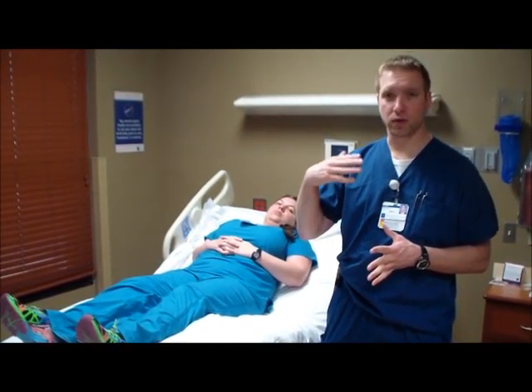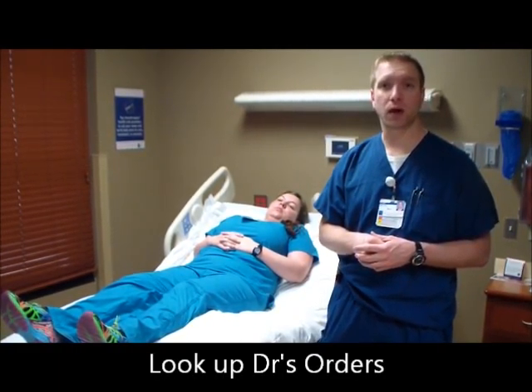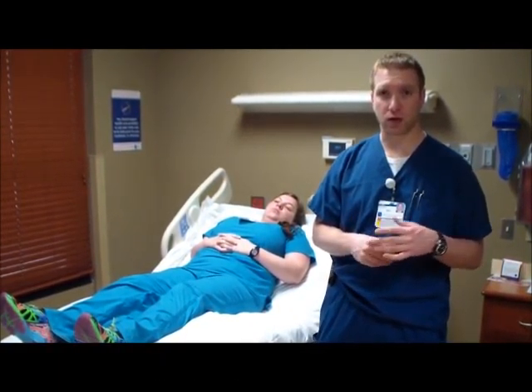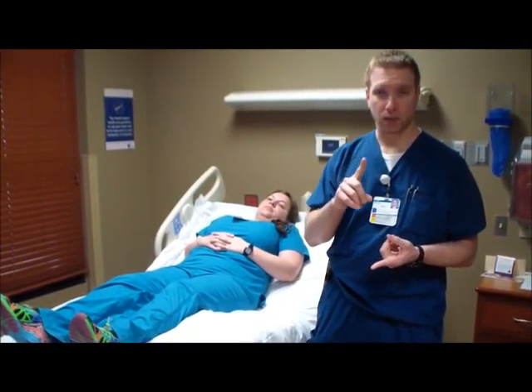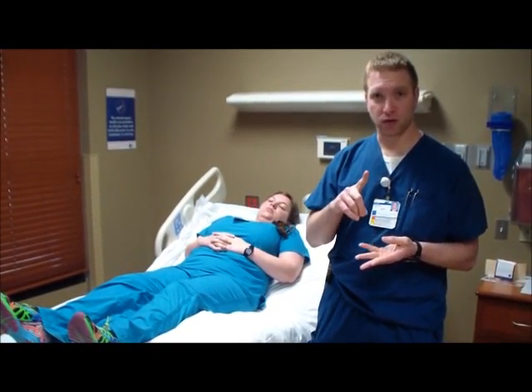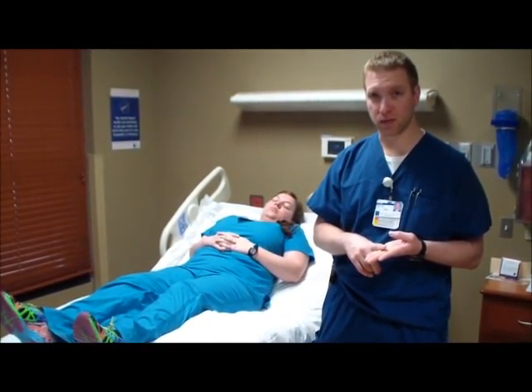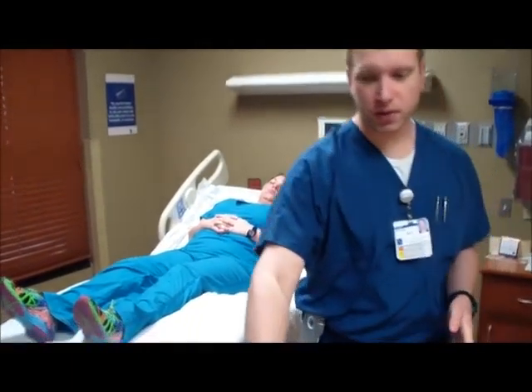Then what you can do is go to the computer, look up that information if you're able to. If not, you want to contact one of the therapists to make sure that you're sure as to what settings to have. So how many degrees of flexion, extension, the speed, as well as which leg you're applying the CPM to. So once you have all the information, you'll want to go and get your CPM cart.